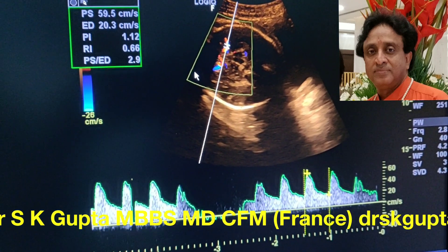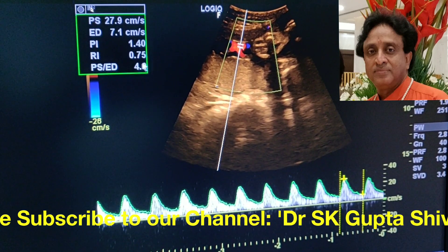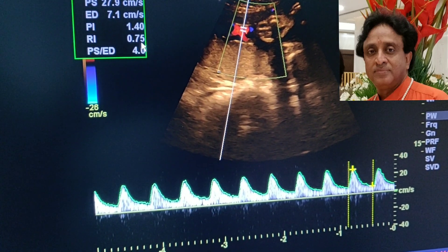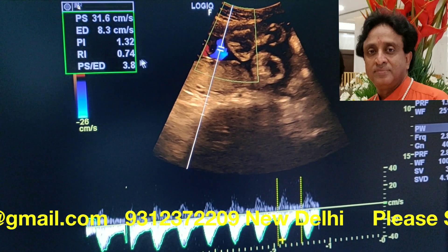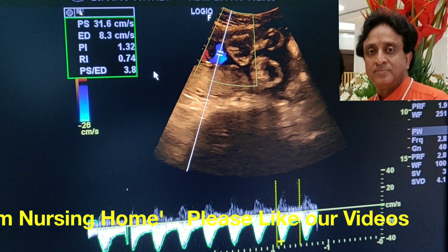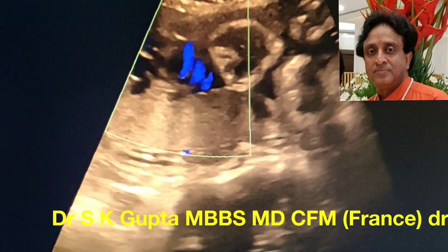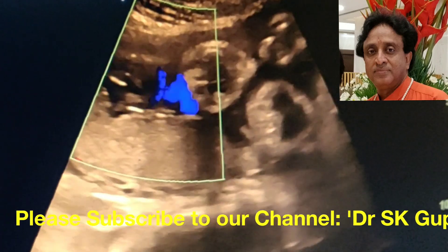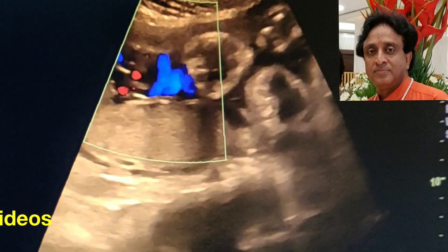Looking at the flow across the umbilical arteries, we find the resistance index is pretty high at 0.75, which is more than the intracerebral middle cerebral artery resistance index. On repeat interrogation, the umbilical artery resistance index remains high, suggesting placental insufficiency and decreased blood flow to the fetus via the umbilical arteries, giving rise to IUGR. The resistance index of the cerebral vessels being less than that of the umbilical arteries indicates a disparity in cerebral-placental flow, consistent with gross IUGR.